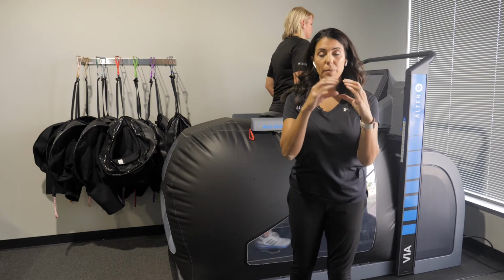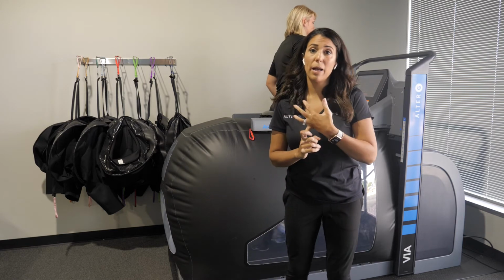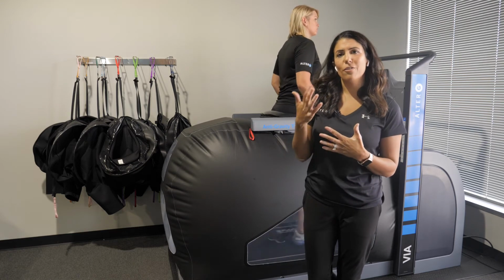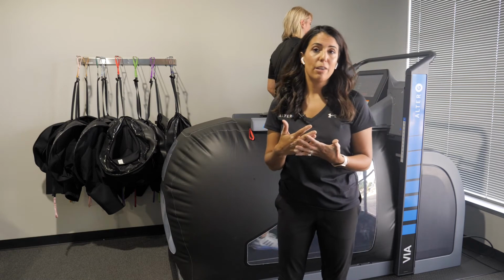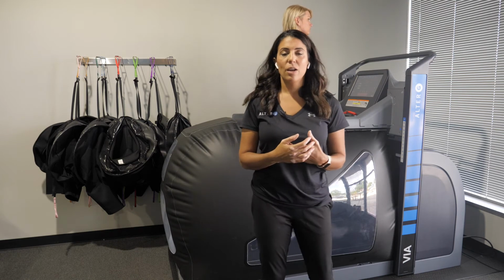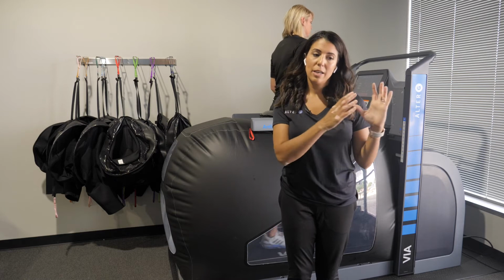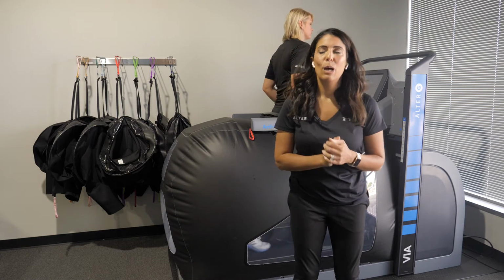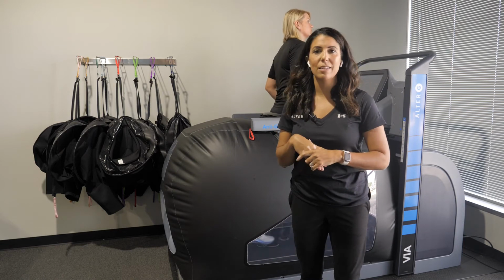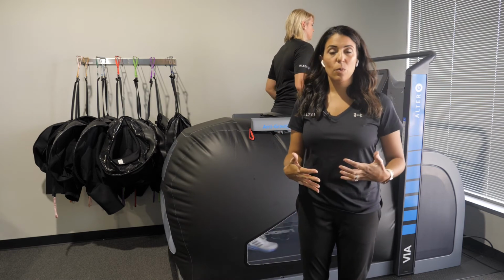And at the end of my session, I'll be able to compare and contrast how her symmetry is affected by changes in her body weight, by changes in her speed, or changes in incline. And this is really interesting for us to be able to justify further treatment or why we're using the treadmill. So if her symmetry is pretty good now at 75%, but when I put her at 85% or 90% of her body weight, her symmetry starts to favor one side again, I know that there's a weakness there, but that she requires the body weight support to be able to walk more symmetrically.